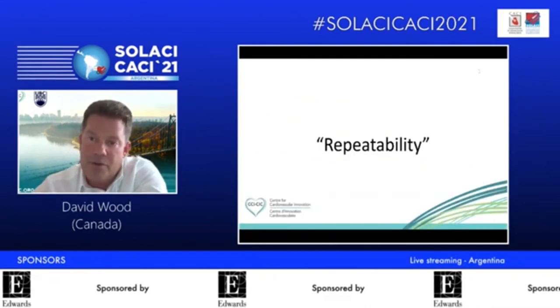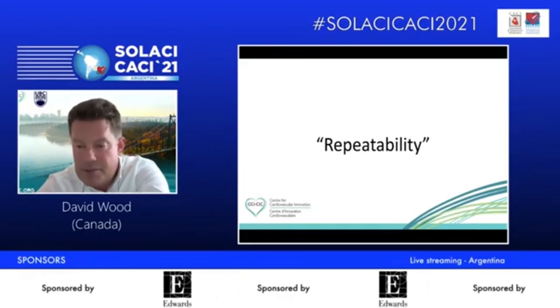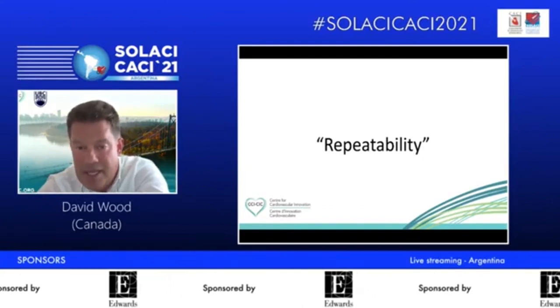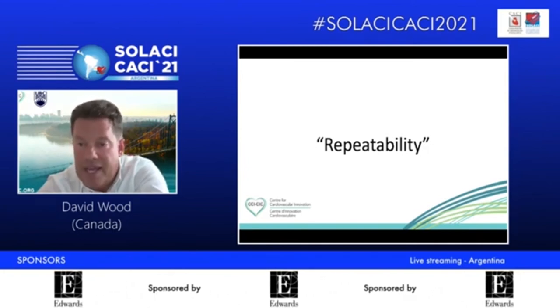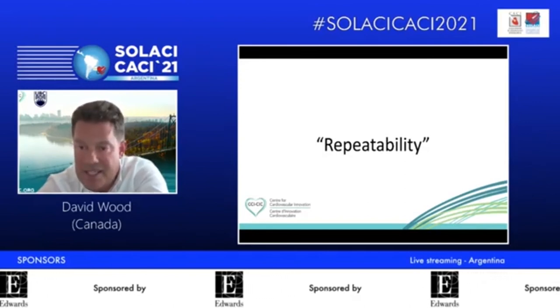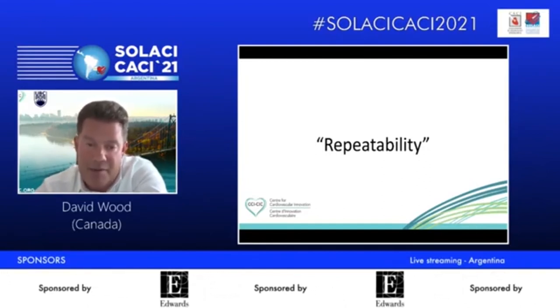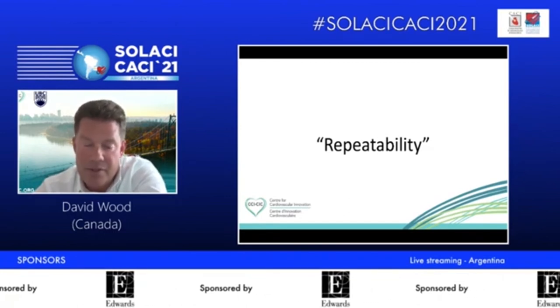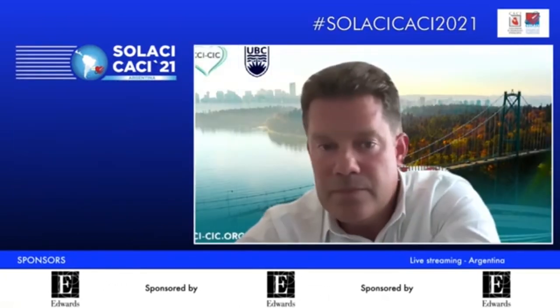So finally, I'll leave you just with that one word. Whatever we're doing in 2021, whatever platform you use, it behooves all of us to think about repeatability, because we really need to think about how we are going to access the coronaries. How are we going to revalve or redo TAVR on that patient? There's obviously new technology coming, looking at leaflets and other things to make this hopefully easier for implanting physicians. But really, this to me should now be the focus in the aortic space, never mind mitral, tricuspid, and all the other fun things we do for our group. So thank you so much.